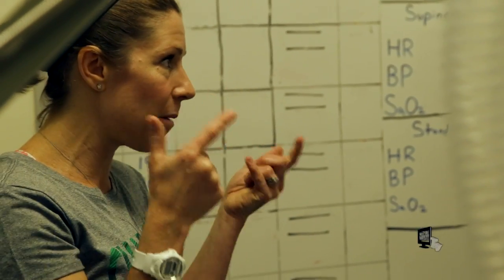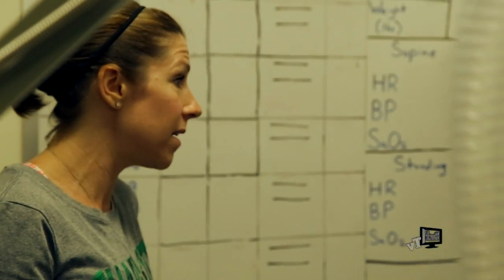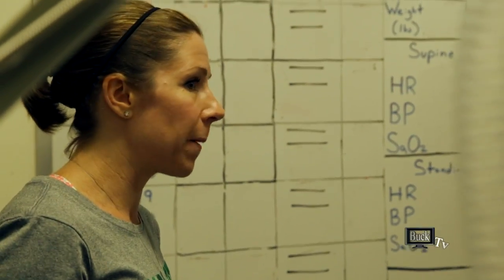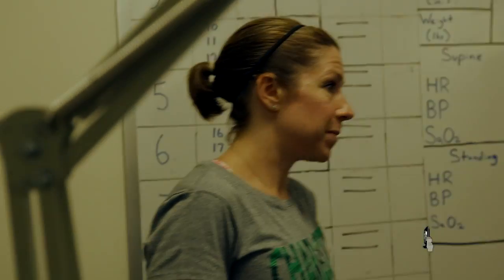If he suspects that the mask is coming loose or coming off his face, he would hop off the belt and we would either stop the test or at least pause it, fix it, and keep going. But if the computer stopped working or something like that, then we would stop the test. Once we're at 7, we'll say the test has started.